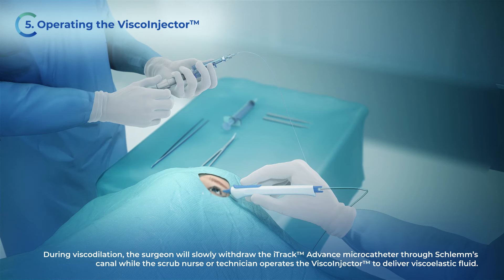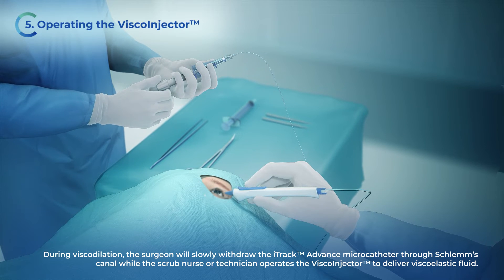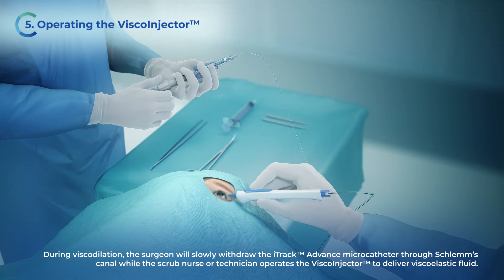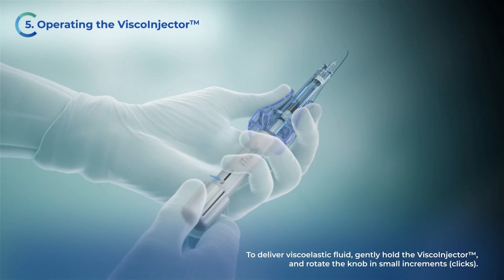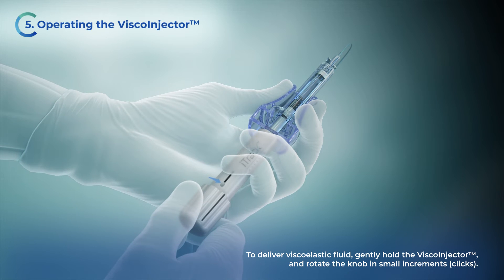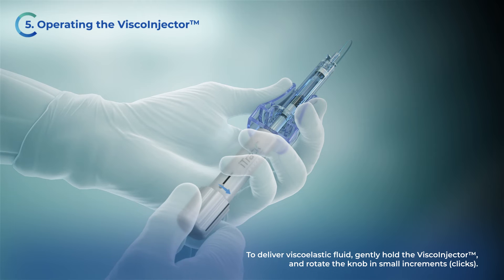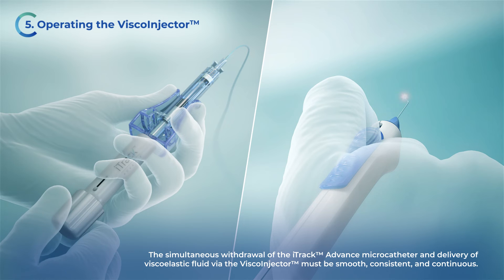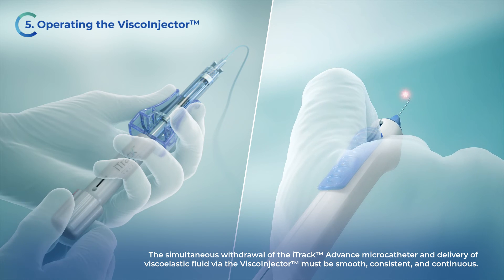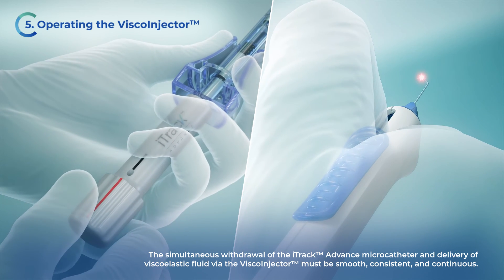During viscodilation, the surgeon will slowly withdraw the iTrack Advance microcatheter through Schlemm's canal while the scrub nurse or technician operates the viscoinjector to deliver viscoelastic fluid. To deliver viscoelastic fluid, gently hold the viscoinjector and rotate the knob in small increments or clicks. The simultaneous withdrawal of the iTrack Advance microcatheter and delivery of viscoelastic fluid via the viscoinjector must be smooth, consistent, and continuous.